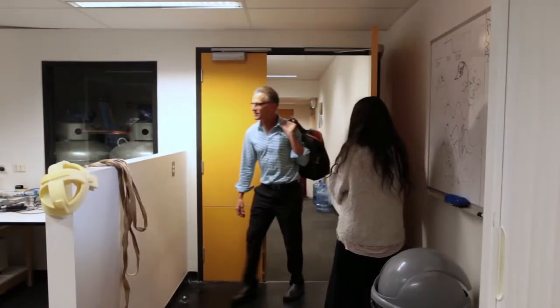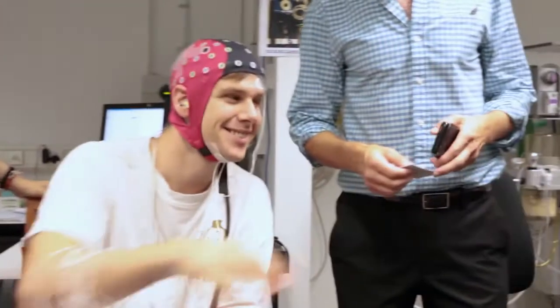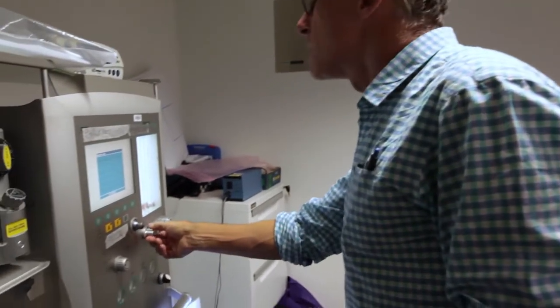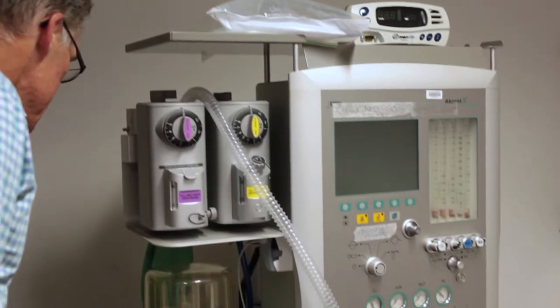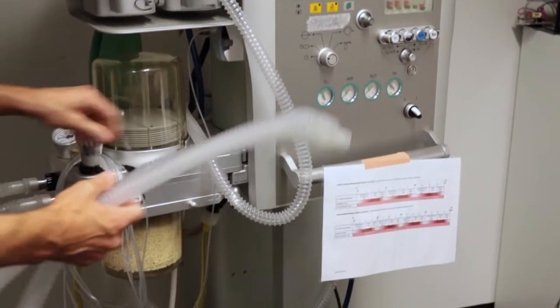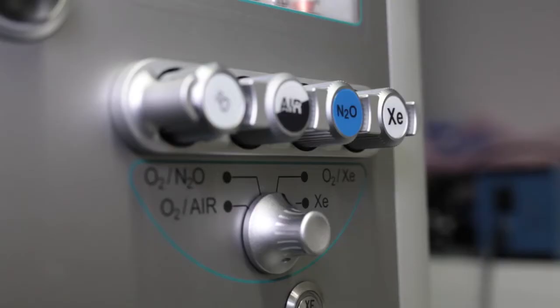It is of vital importance that the administration of anesthetic gases is supervised by a physician anesthesiologist at all times. As well as patient monitoring, the role of the physician anesthesiologist includes ensuring the adequate configuration of the anesthetic gas delivery unit, specialized, in this case, to deliver and monitor xenon.